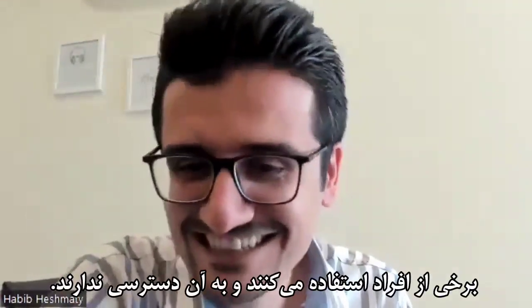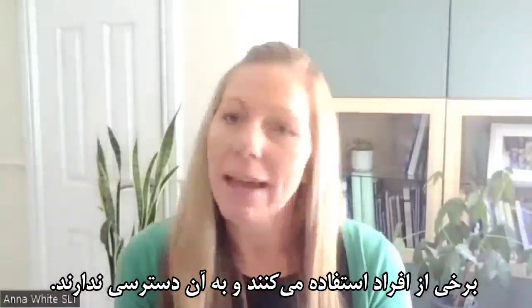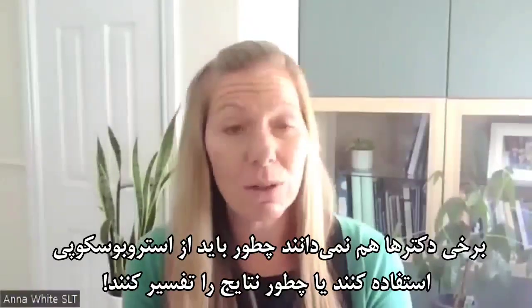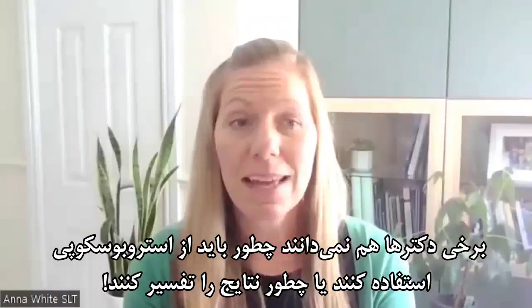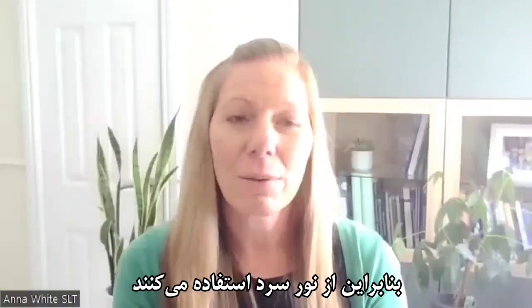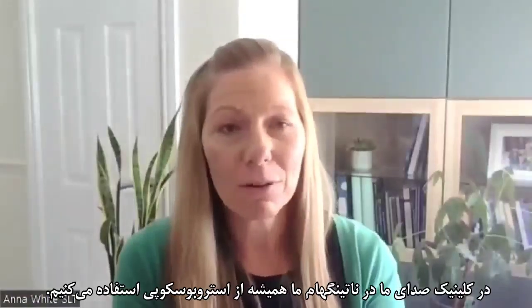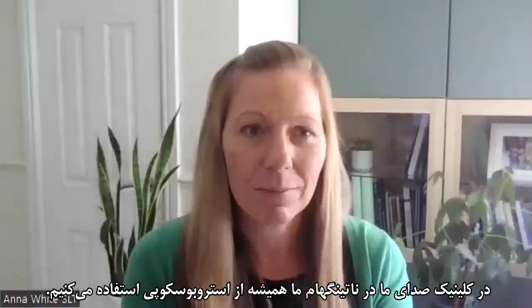Some people will not have access to it, and some doctors will not know how to use stroboscopy or interpret it and may just use cold light. So we still have many centres where it isn't used. In our voice clinics in Nottingham, we will always use stroboscopy.